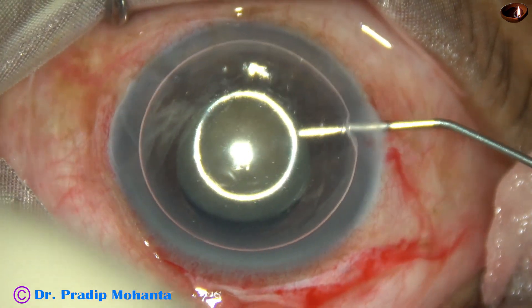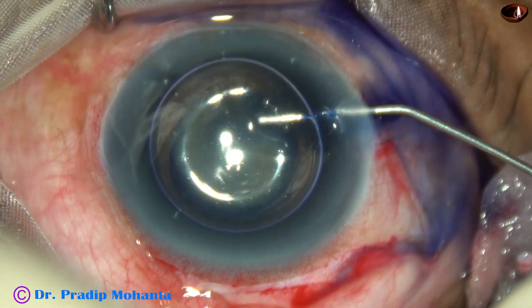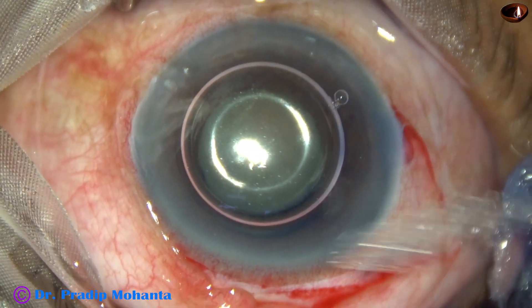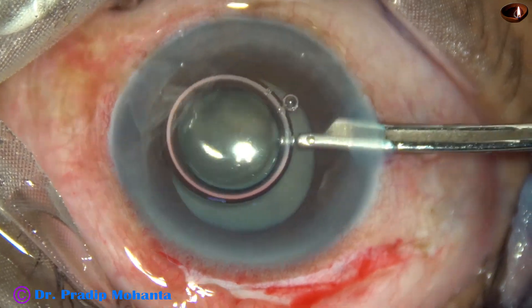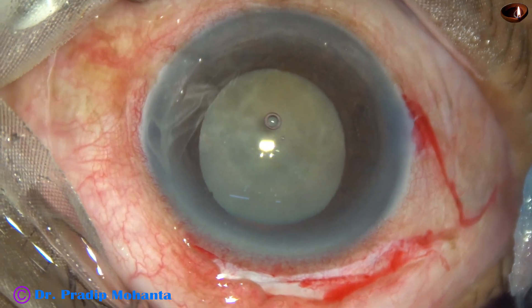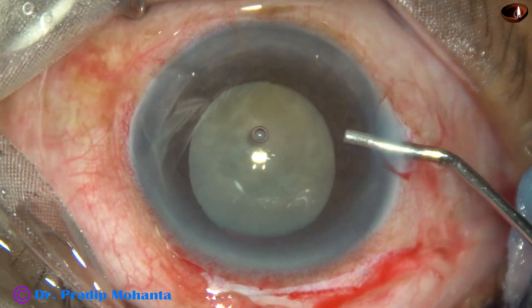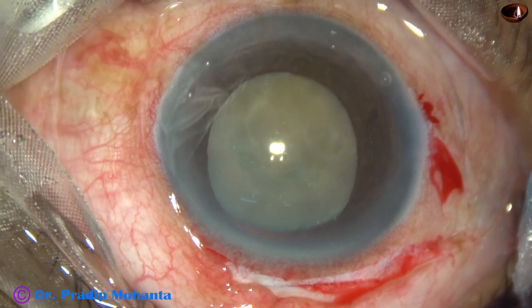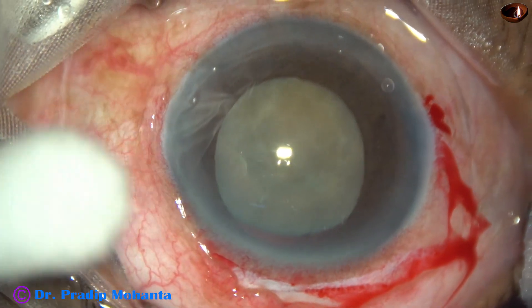A side port is made at nine o'clock. Trypan blue dye is used to stain the anterior capsule. Now the dye is washed out.